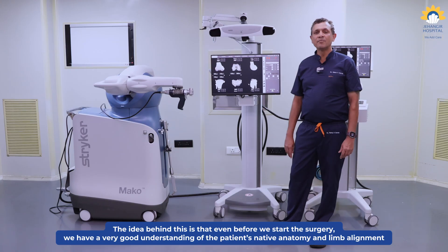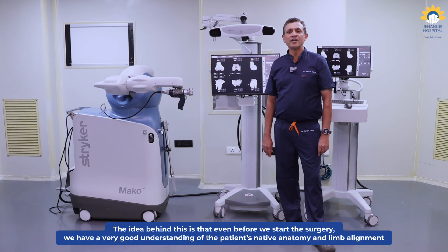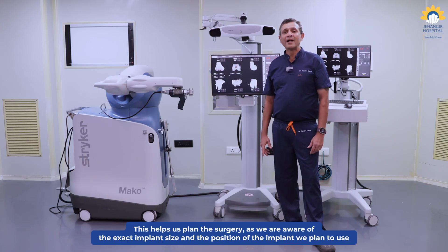The idea behind this is that even before we start the surgery, we have a very good idea about the patient's native anatomy and the limb alignment. This helps us plan the surgery better as we are very well aware of the exact implant size and the position of the implant that we plan on putting during the surgery.